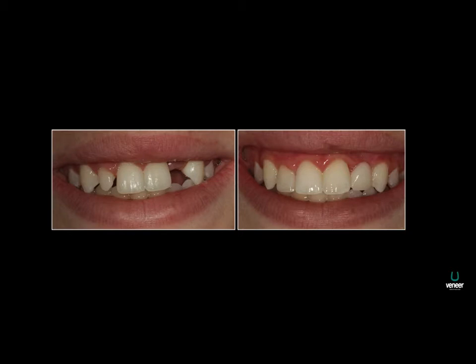So in those cases, you have to tell the patient to avoid biting directly on the tooth. You have to do some clearance at the back. Don't have a premature contact, even if you have to make it a little bit shorter. It is much better than giving them the removable partial denture, which patients don't really have the desire to wear, and they really don't like the removable partial denture. This is an excellent solution.